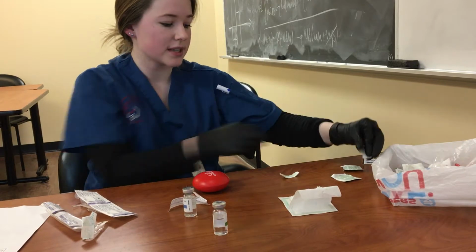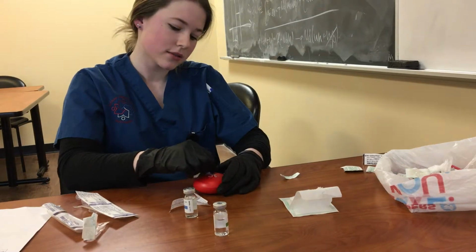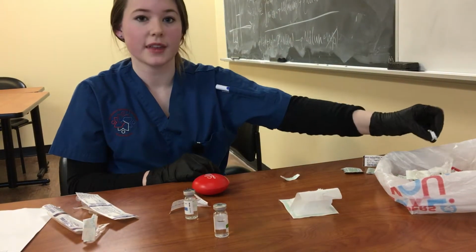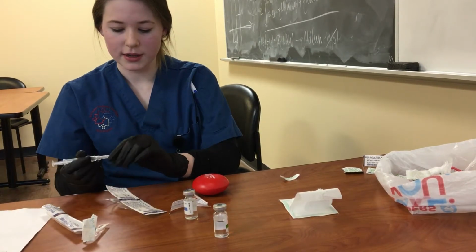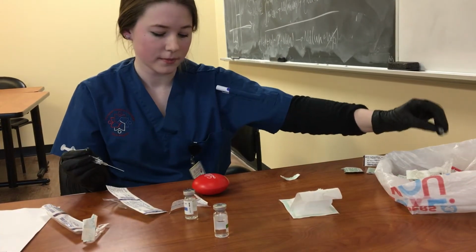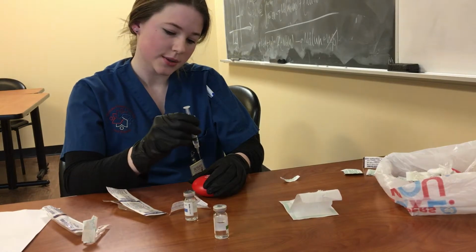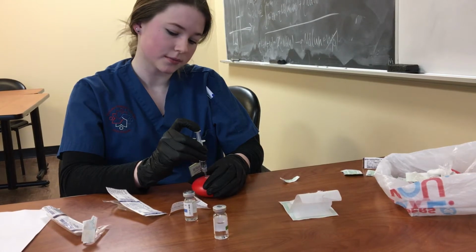Perfect. And from this point, I'm going to open my new alcohol swab. And I'm just going to cleanse the area, moving in an inner to outer fashion. I can remove that in my garbage. Perfect. So I'm just going to remove the cap on the needle, and I'm going to flatten it and then pinch, making a Z-track motion to ensure the medication stays in the muscle. So again, I'm going to insert at a 90-degree angle and inject the medication slowly.